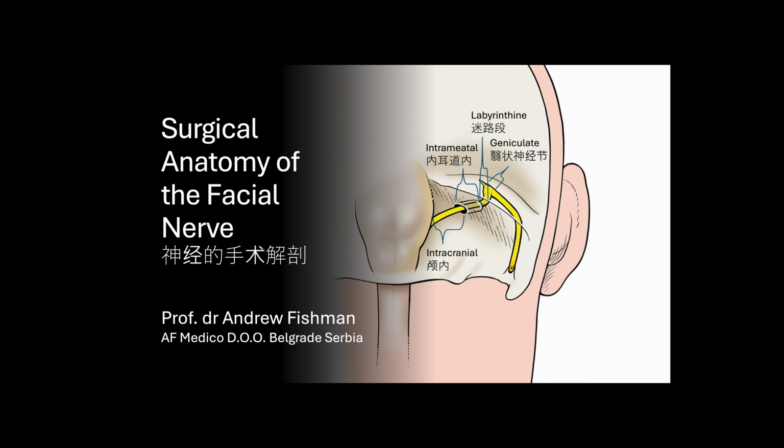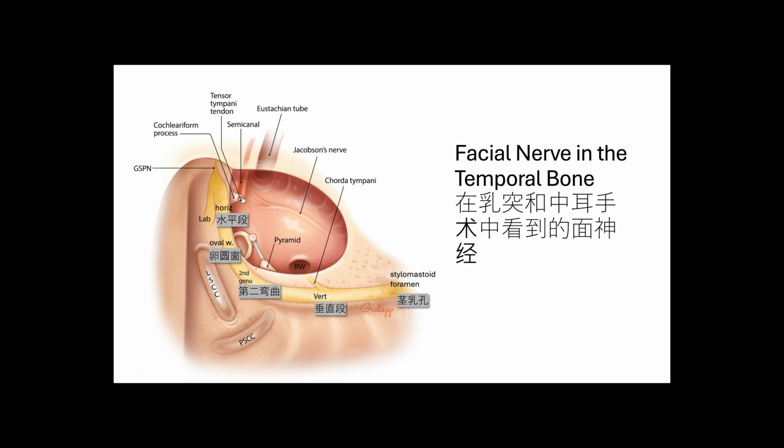The full extent of the intratemporal and intracranial facial nerve is encountered during transtemporal surgery of CP angle lesions. Middle ear and mastoid surgery is localized to the intratemporal segments. These procedures include tympanomastoidectomy, stapedectomy, and others. Parotidectomy usually requires access to the extratemporal distal segment, where the nerve exits the stylomastoid foramen and enters the parotid gland to innervate the mimetic facial muscles.